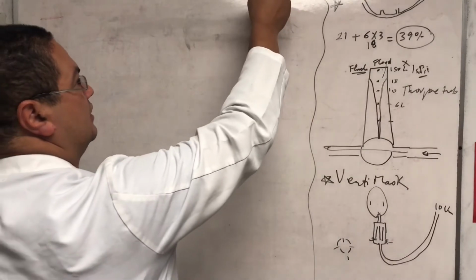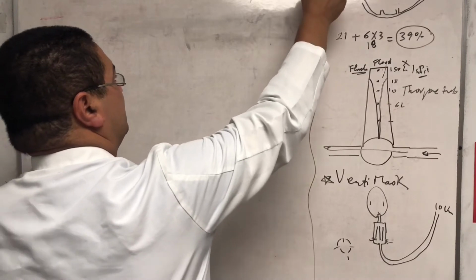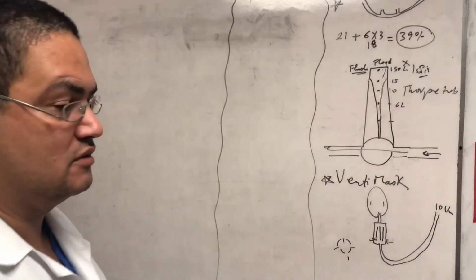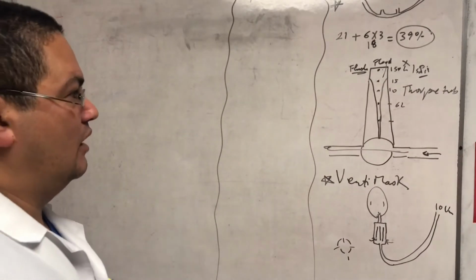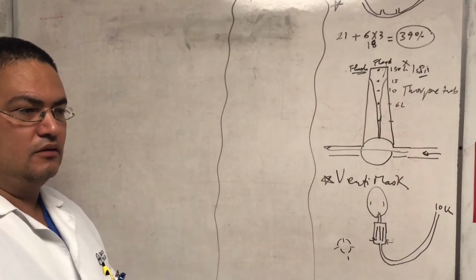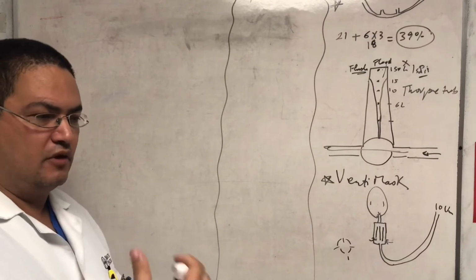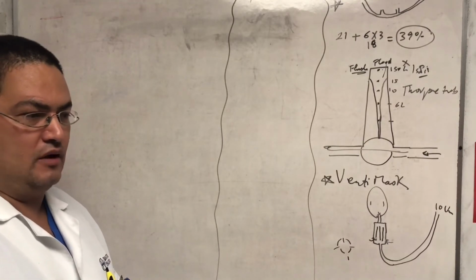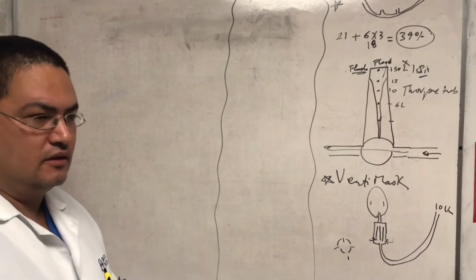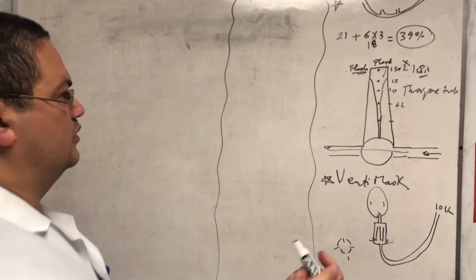Next, we're going to talk about the non-rebreather mask. And some people, there was a movement to call it rebreather mask. I don't know why you call it rebreather mask. I think non-rebreather makes more sense, but it doesn't matter, rebreather or non-rebreather. The idea is that you are rebreathing. It's not rebreathing. It's actually you're pulling in from a depot of oxygen, or some collection of oxygen, which is the bag. So you're not rebreathing it. You're just breathing from oxygen source. It has nothing to do with rebreathing or non-rebreathing.